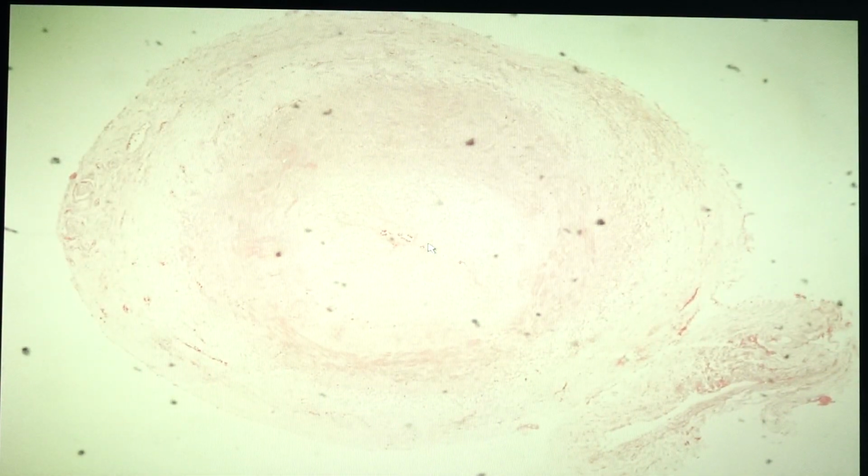This is temporal arteritis. Okay, so this is a slightly faint stain, and it shows to you the temporal artery. So this is a temporal artery tissue. This is also called giant cell arteritis or temporal arteritis. Take note when you are going to diagnose this one, this is only seen in older individuals aged 50 and above, and they would be identified with fever, fatigue, and weight loss, which are constitutional symptoms.